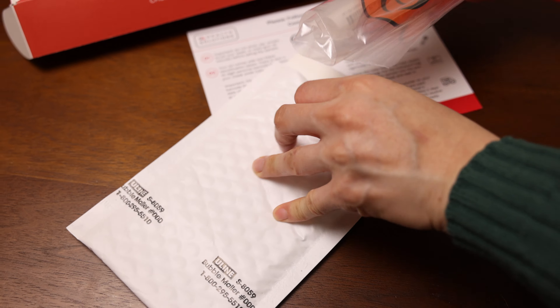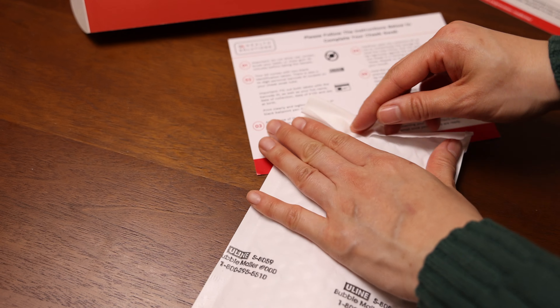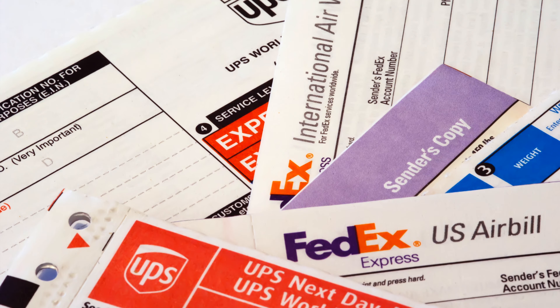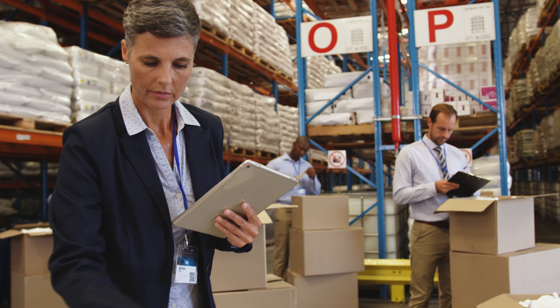Put the biohazard bag containing your sample into the prepaid postal mailer and seal closed. Note the name of the courier on your prepaid label. Send the package within two days of collecting your sample. You'll receive an email once your results are ready and can book a consultation to discuss your results if needed.